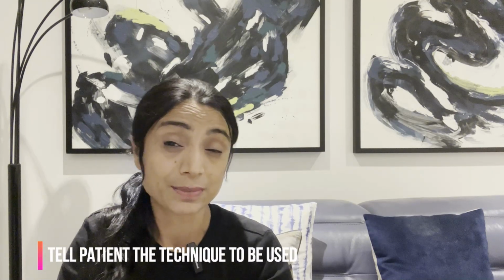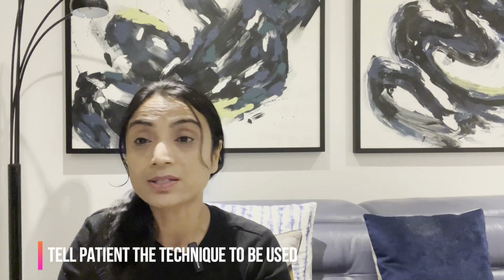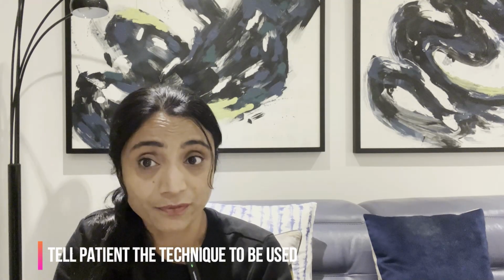Number three is that you need to clearly tell your patient, before you start setting up your equipment and everything, which technique you are going to be using, because your marking criteria now has this bit of confusion. Your marking criteria is talking about two techniques. One is the hold-breath technique and one is the multiple breath technique, which we call tidal breathing. You can use either of them, okay?